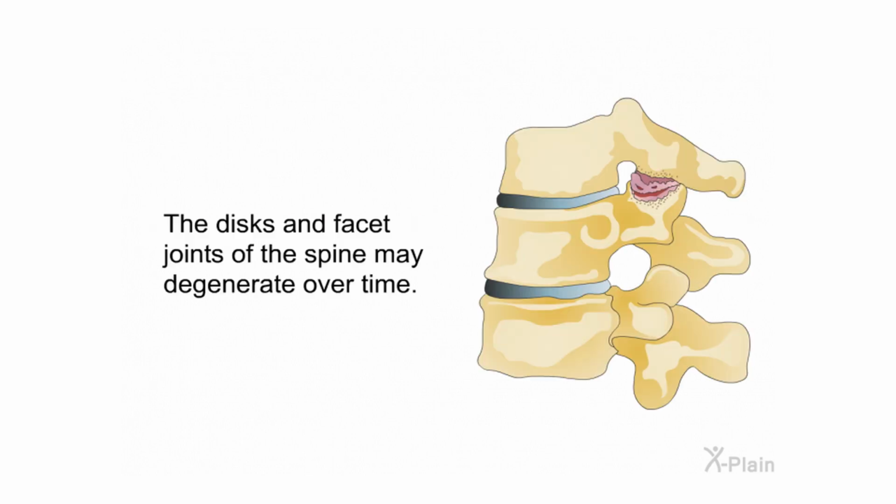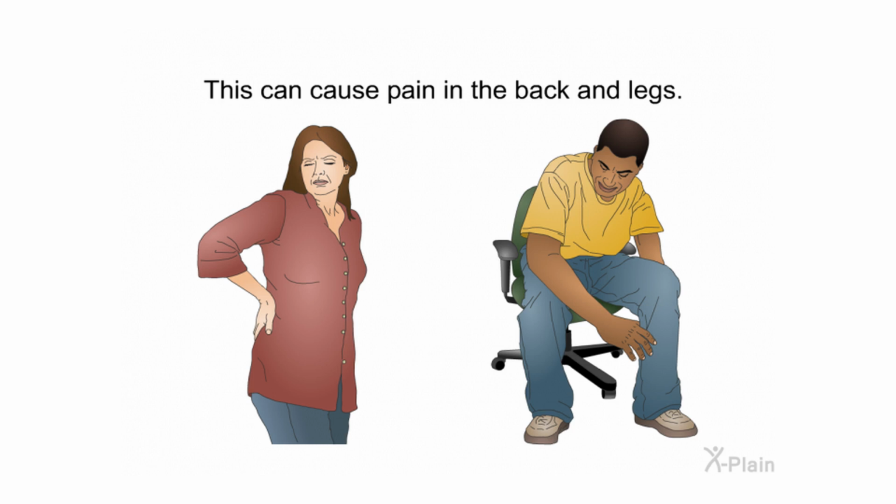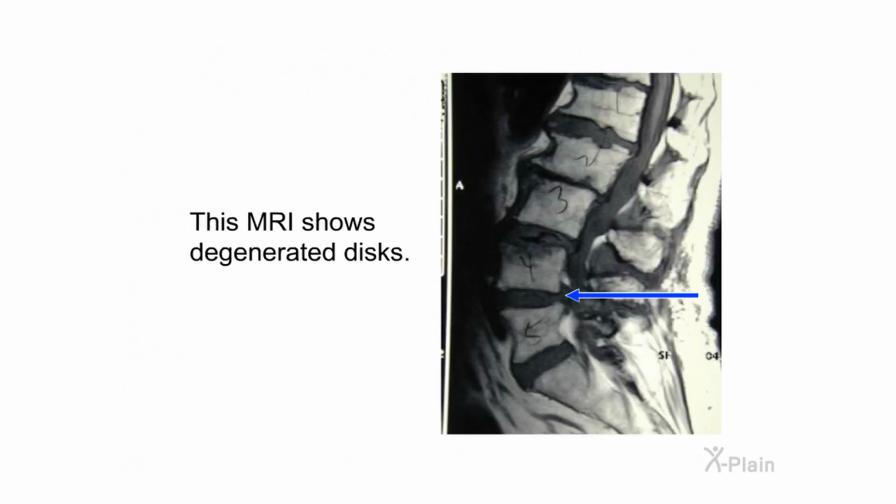Symptoms and their causes. The discs and facet joints of the spine may degenerate over time. This can cause pain in the back and legs. This MRI shows normal discs. This MRI shows degenerated discs.